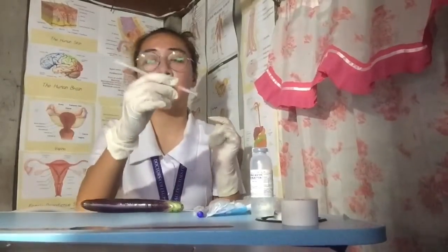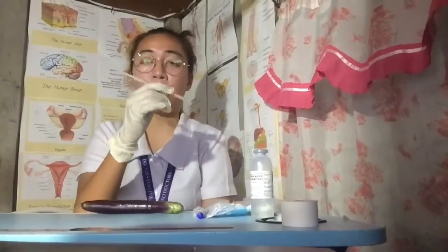Hold the barrel of the syringe steady with your non-dominant hand, and with the dominant hand, pull the plunger to aspirate for 5 to 10 seconds. If blood appears in the syringe, withdraw the needle, discard the syringe, and prepare a new injection.